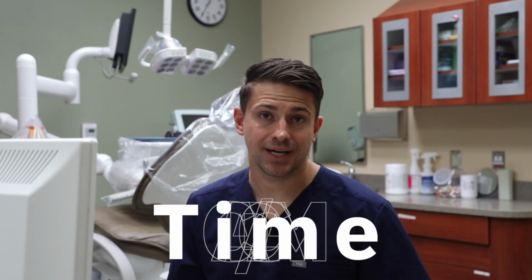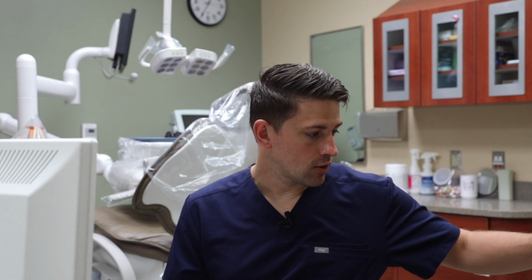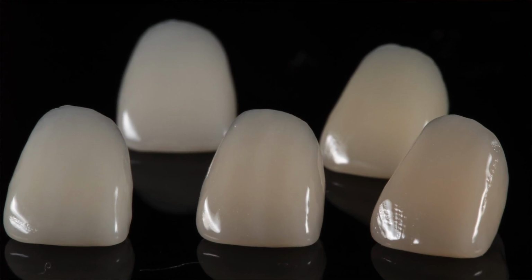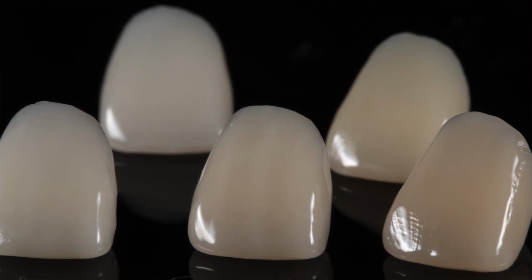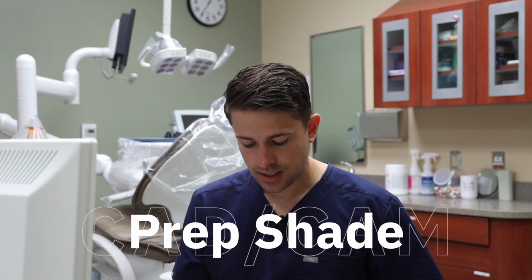Now, really, the whole process is pretty simple. However, you do spend some time actually working on this custom shade guide. And what do I mean by a custom shade guide? Well, so far, I'm not very far into this process yet, but I've milled out some e.max crowns, and I'm in the process of firing these and then actually glazing these. And then I use a product called Natural Die Material to create a stump shade or a prep shade. And this crown, in combination with that Natural Die Material, allows me to create a custom shade guide to verify the shade of a restoration for any patients I'm going to do e.max on.